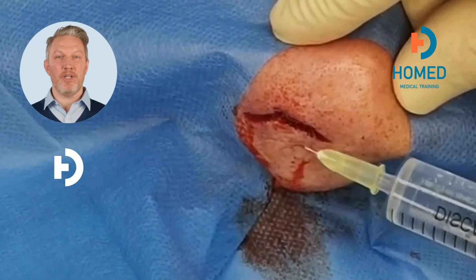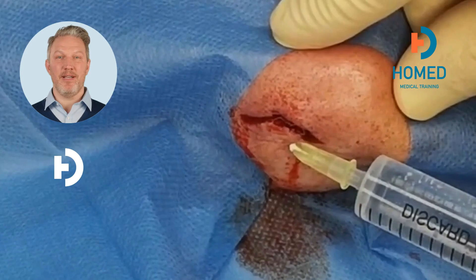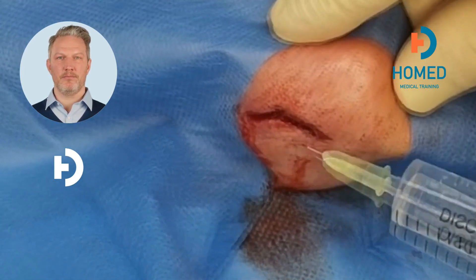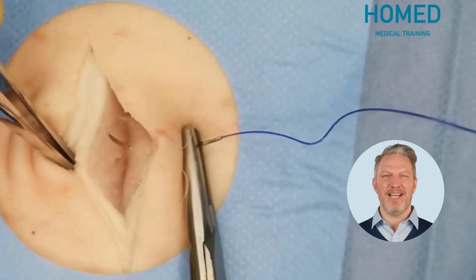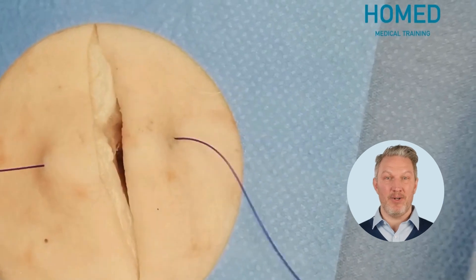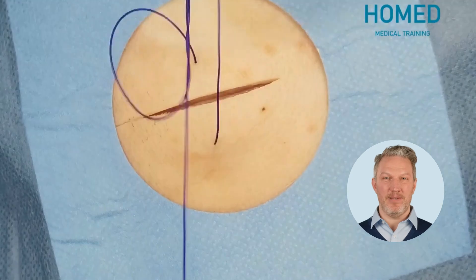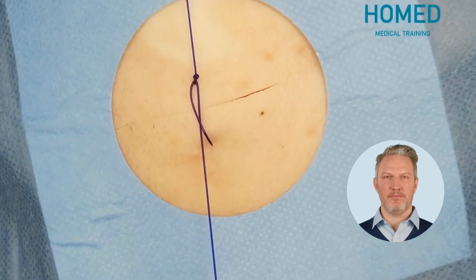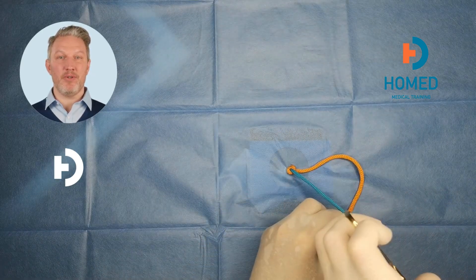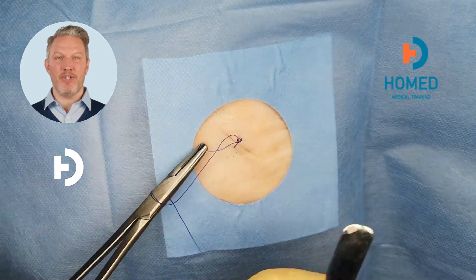We also go through local anesthesia — what it is, when to use it, and how to apply it safely and clearly. Then comes a classic: the simple interrupted stitch. I'll show you how it's done and share some easy tips to help you avoid common mistakes. You'll also learn how to tie a strong knot using the needle holder so your stitch stays right where it should.